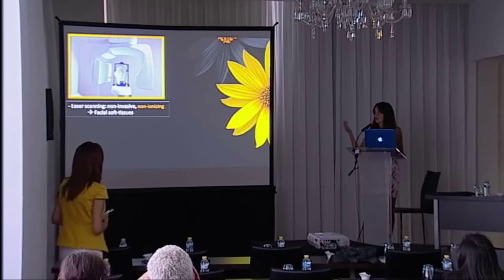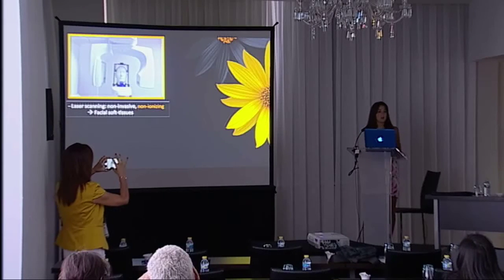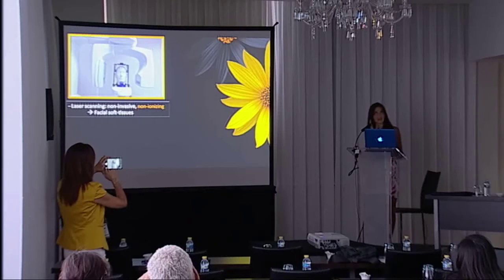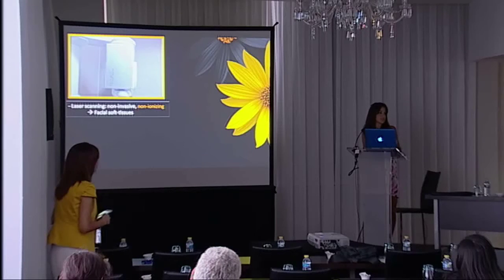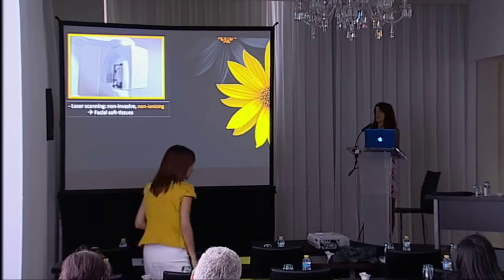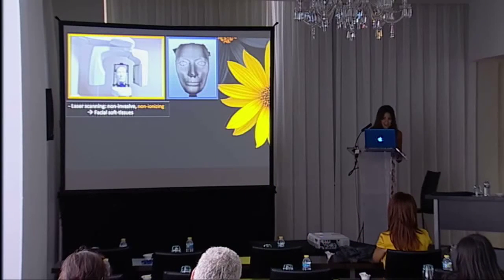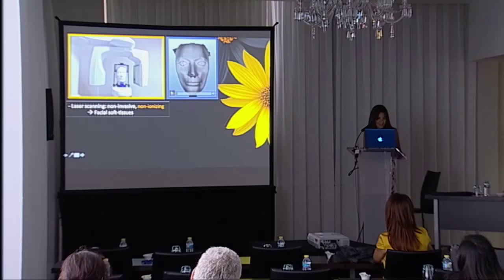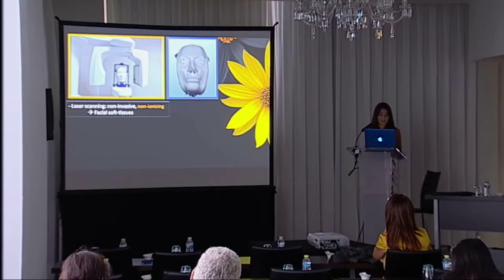While rotating around the patient's head, as you can see in the video, the small cameras will record the colors of the face, while the laser scanner will capture the surface texture. Then the colors will be stitched on the surface texture to give the final reconstruction that can be seen in 3 dimensions. I will show you. So here's the virtual reconstruction of the face. This is a phantom head, just used here for illustration purposes.